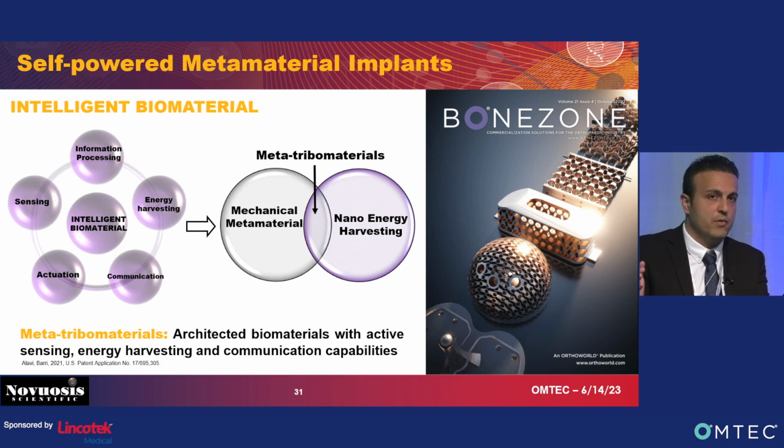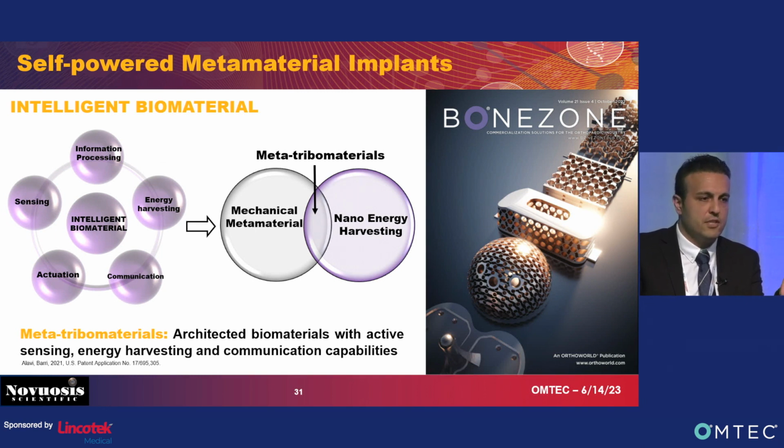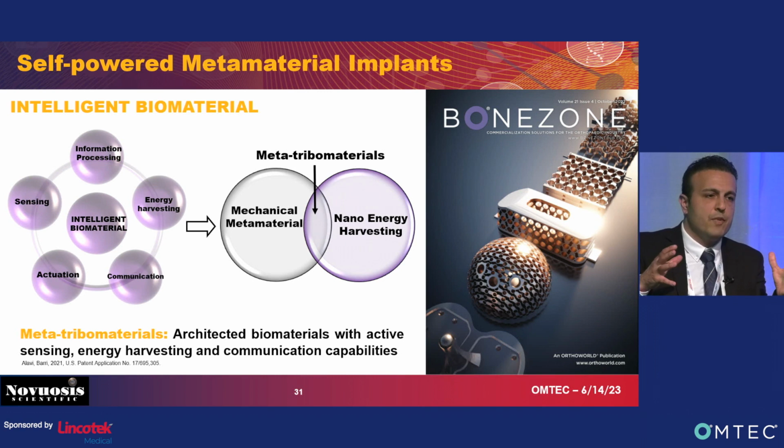For those who are not familiar with mechanical metamaterials, this is an interesting area of research which has been getting a lot of attention recently. It's about how we can create artificial structures or artificial material systems that get their properties from their design, not their material, not their chemical composition.